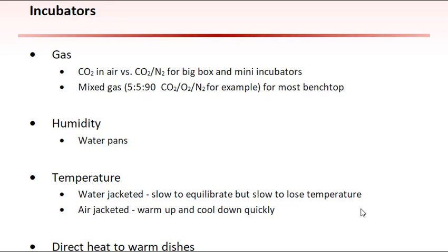Traditionally, incubators were set up based on cell culture methods with the CO2 percentage set to 5%. At this setting, the pH of a 25 millimolar bicarbonate solution should be approximately 7.4. However, as will be discussed, many variables have an impact on pH, including elevation, humidity, and media composition. Many labs choose to lower the pH of their culture systems and thus increase the CO2 concentration during culture.